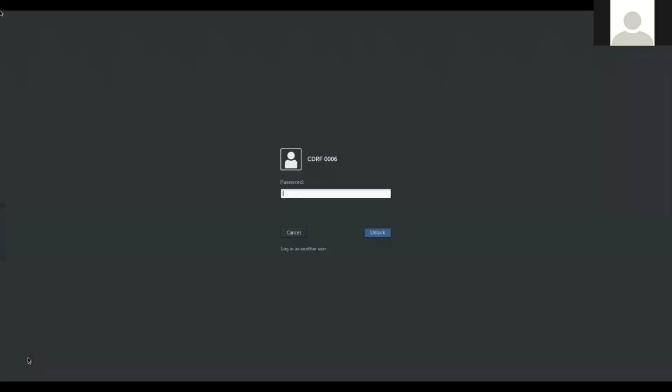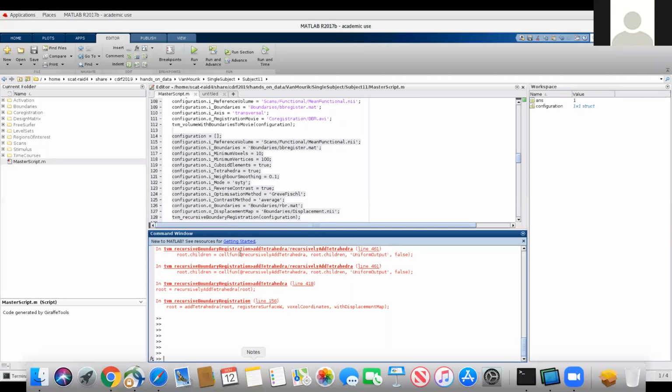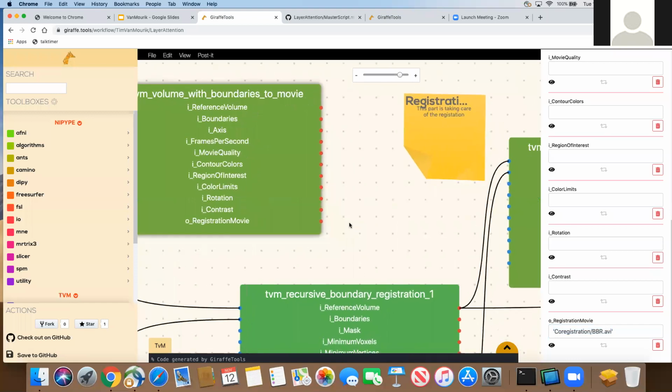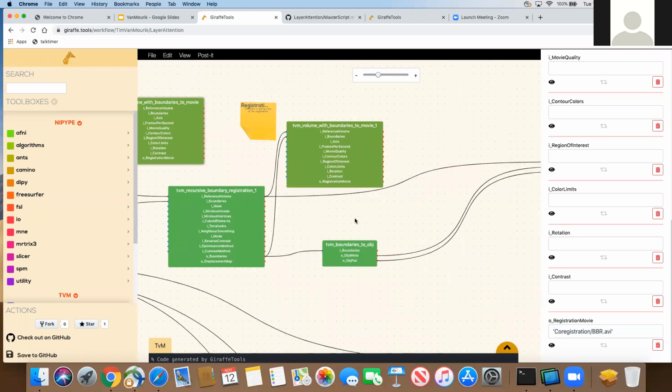I'm certainly not arguing that T2 star contrast would ever be enough. I'm arguing, as I interrupted you this morning, to say if you don't acquire in the scanner an image that has T1 contrast to support your registration down the road, you missed an opportunity to come closer to an objective metric for guiding your registration. I have to admit the T1 MPRAGE takes a lot of work. It might not be perfect, but it's the best that we have.